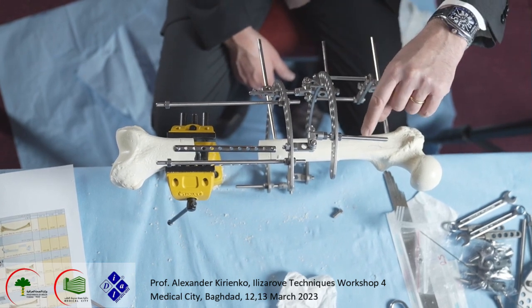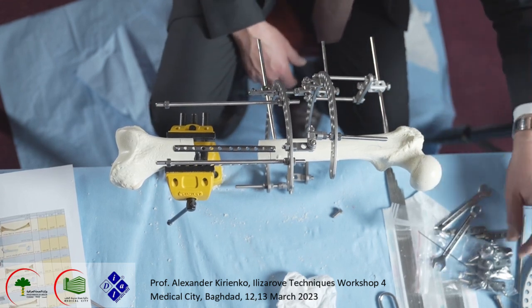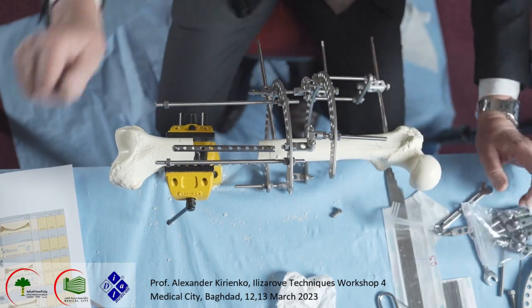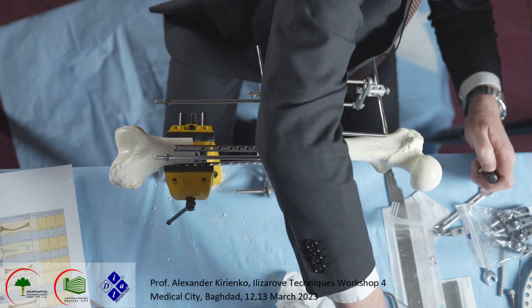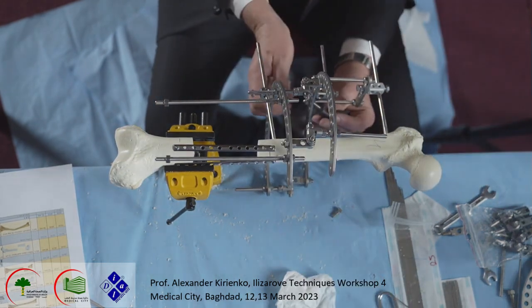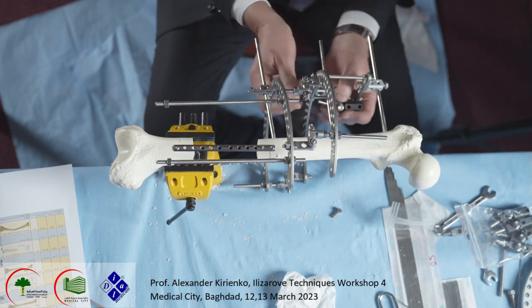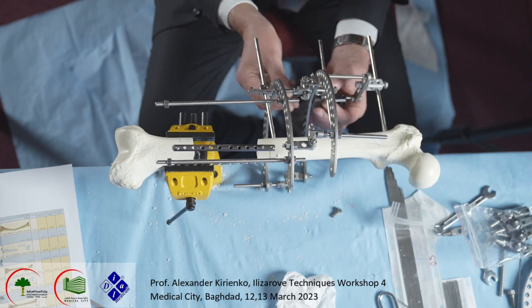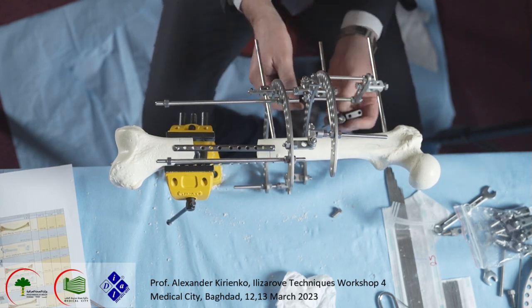I usually put 3 or 4 half pins on the proximal part. Maybe for example we put this oblique support like this, because this creates 3-dimensional fixation. Maybe the 5 millimeters, yeah. 5 millimeters.